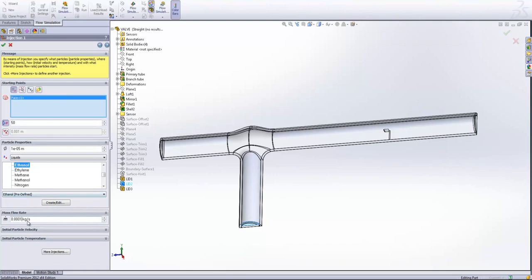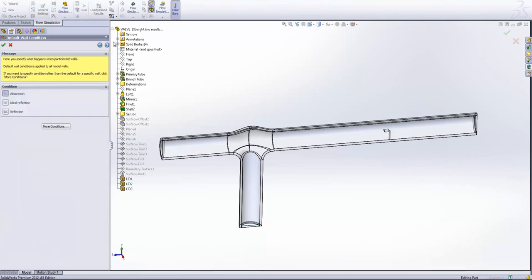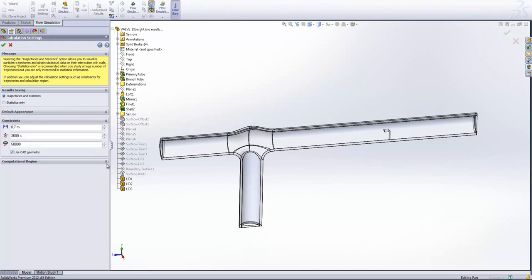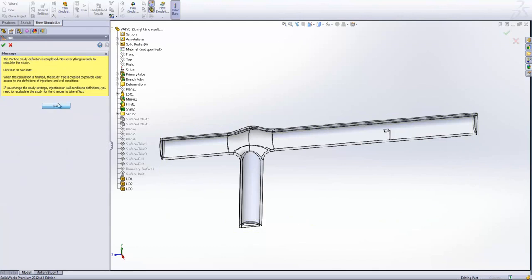So I'm going to use fairly similar values, the same mass flow rate that we had specified on the inlet boundary condition. And here we can specify how those particles are treated. They can either be absorbed when they encounter a wall, or we can have them reflect. We can specify reflection parameters, so we can have some absorbed, some reflected, or we can have an ideal reflection where all of the particles that encounter the wall bounce straight back off again. A couple of other physical features, we can include erosion, accretion, and gravity here, and then we can tell the system what information we want out of the study, hit next, and hit run.